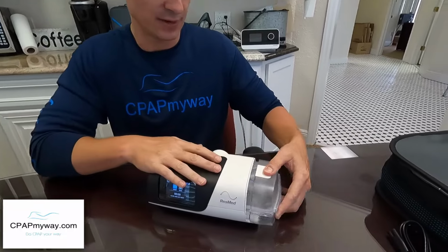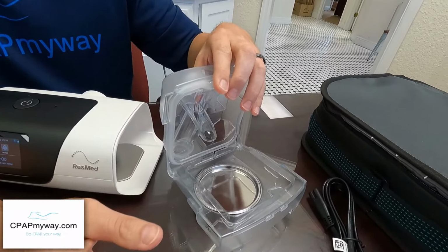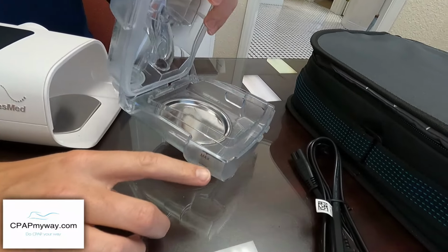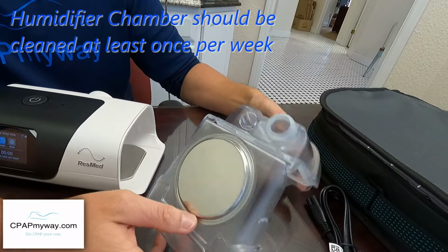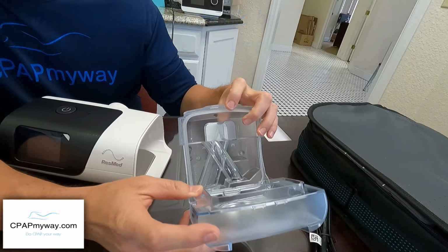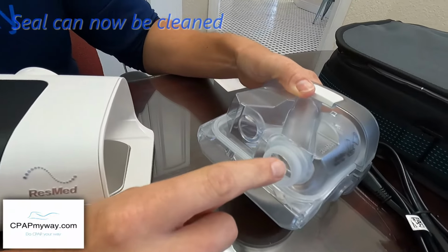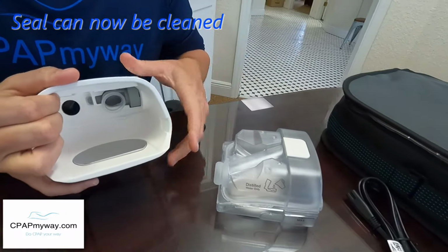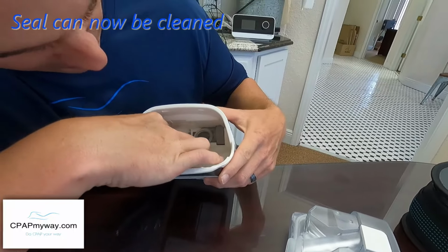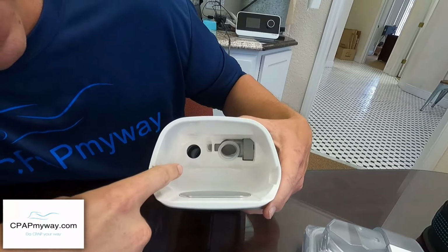As far as maintenance on the AirSense 11, it is very similar to any other CPAP. You've got your humidifier chamber on the side, which slides out. You open it up. This is where you will obviously fill your water to the max. It's best to empty the water daily, let it air dry. It can be washed soap and water or a top rack of the dishwasher as well. One thing I'll point out is it does have the seal on the side, which is something I really like, as opposed to the seal on the inside of the machine where it used to be down in there, on the AirSense 10 model that is.